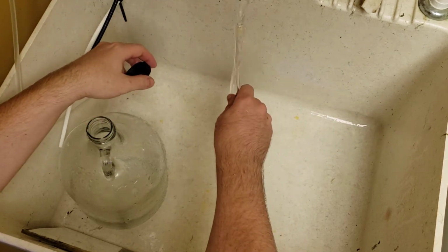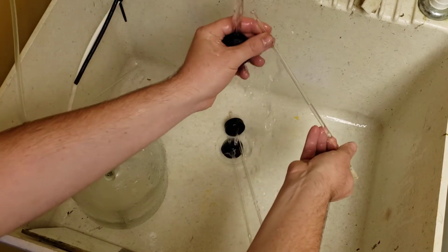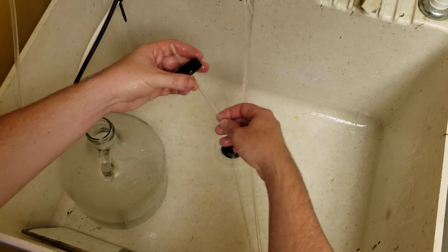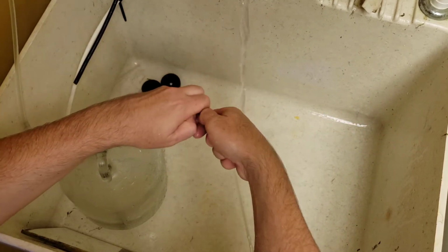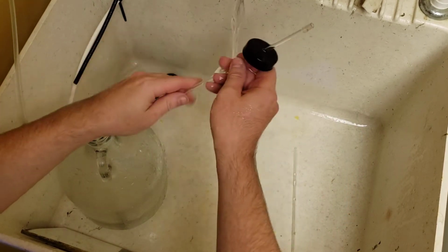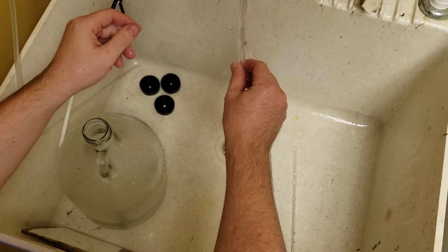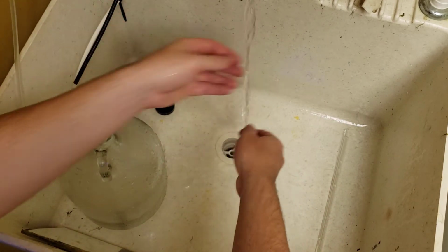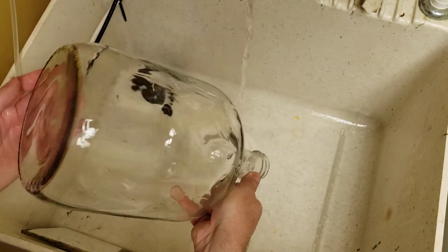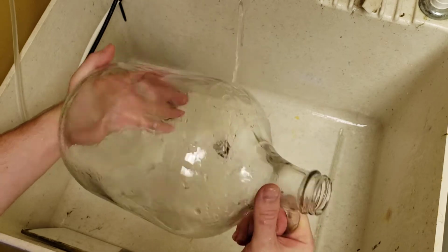So for these, what I do is I actually soak these in a bath to get the calcium out of the inside and sterilize the outside. So these will take a little bit more of a process. The lids I also soak in a solution of the acid. Basically, by the time I'm done with my dishes, everything is like new again. So those I'll put aside and clean later. Just another rinse. Now for these, I'm going to take these over to the microwave, start heating up some water, and I'll show you that next.